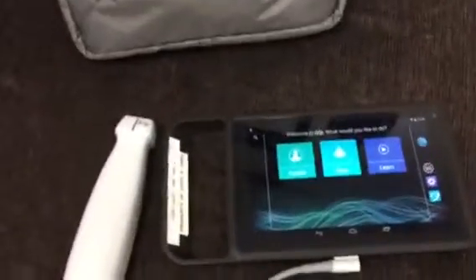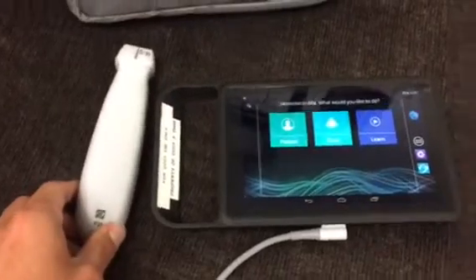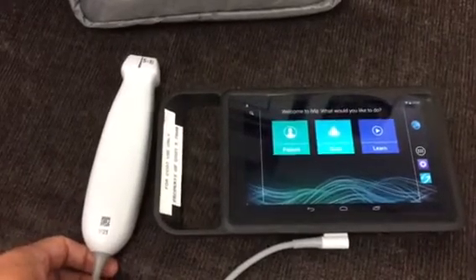This is the new iViz system. It's an ultra-portable ultrasound system that we have acquired, one for each CCOT service at each site. The idea is that we no longer need to move machines out of the unit to accommodate CCOT scanning on the wards.